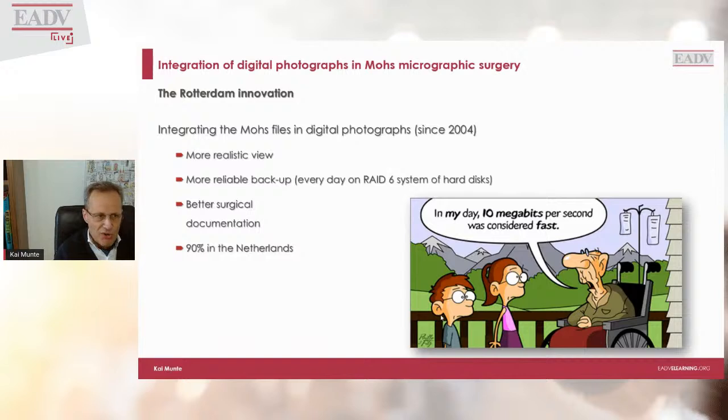Then to point out the Rotterdam innovation, because we are integrating the Mohs file into digital files with photographs, which creates a more realistic view, a more reliable backup, and in my opinion, it's a much better surgical documentation. And right now, almost 90% of all micrographic surgery performed in the Netherlands is performed in this manner.